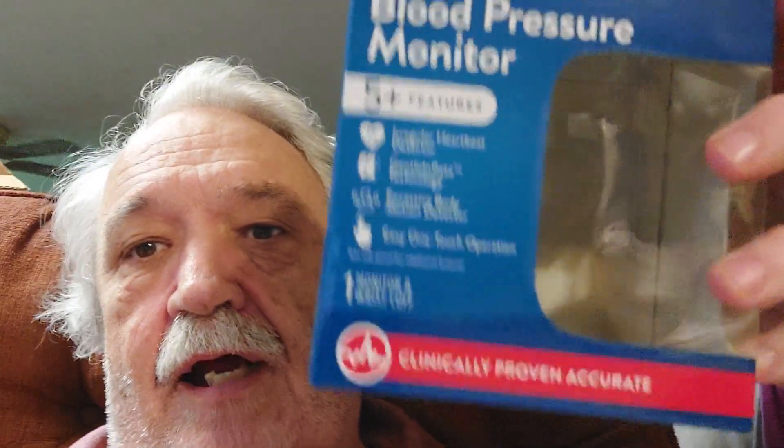I found that this Walgreens unit — auto wrist blood pressure monitor — is clinically proven accurate. It has an irregular heartbeat detector, gentle inflate technology, excessive body motion alarm, and easy one-touch operation. It takes two AAA batteries, which I think were included. They had numerous models there; as you paid more, they had more features — multiple users, and eventually they connected with devices and all that.